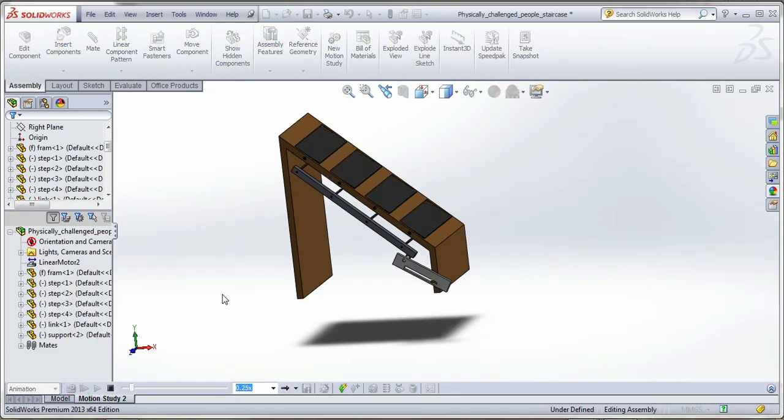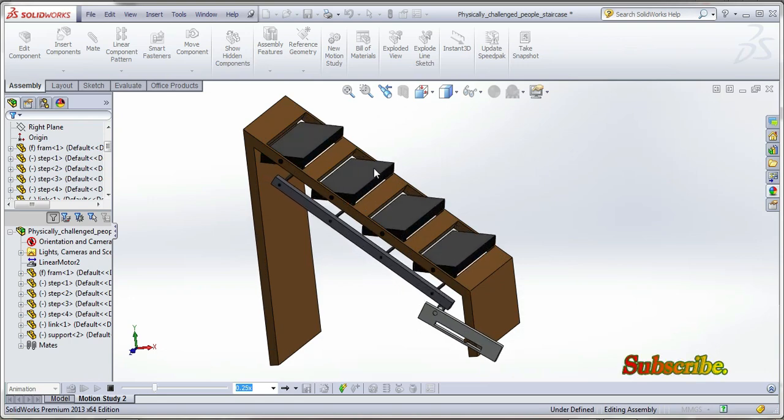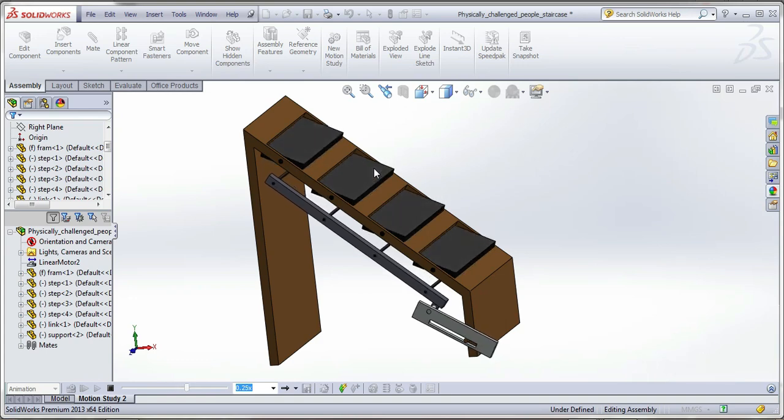I'm going to animate. Okay, this looks very nice. Open and closed.